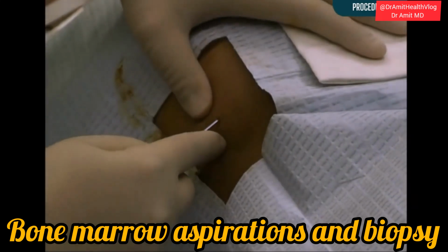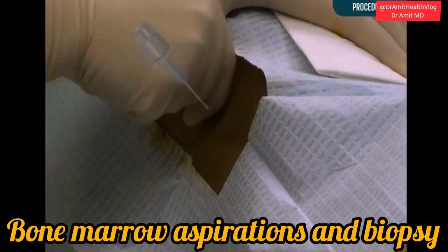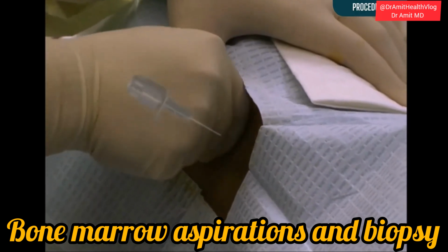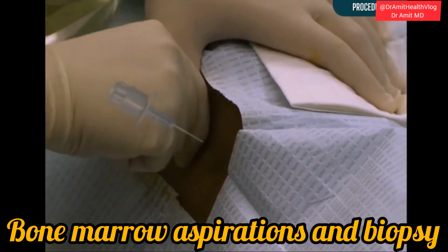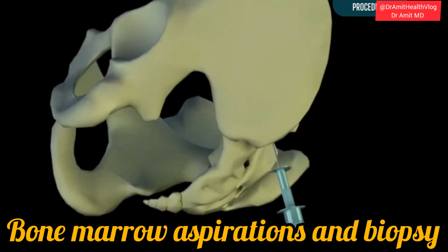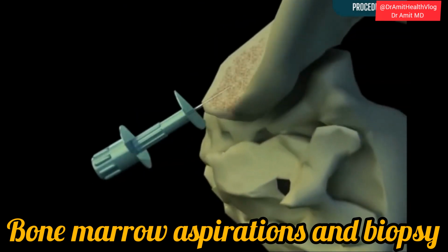Hold the needle horizontally and insert it into the skin over the posterior iliac crest. Advance the needle until it contacts bone. To engage the bone, the needle should be rotated alternately, clockwise and counterclockwise, while applying steady pressure. When the marrow cavity is entered, a sudden decrease in resistance is usually felt. The ilium is a large bone, and the marrow space should be located easily.